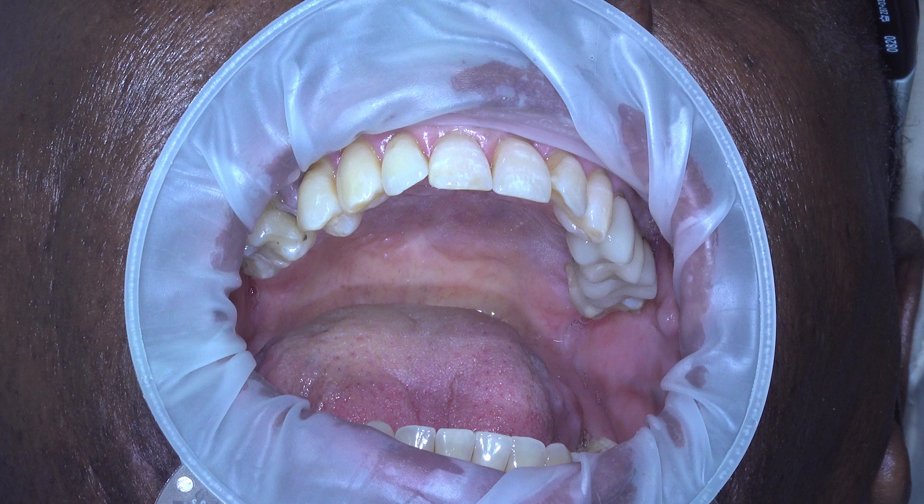Welcome back, friends, to another edition of Implants Made Simple. Today we have a live surgery, uncut, narrated over in the tooth number four position. So let's go ahead and get started.